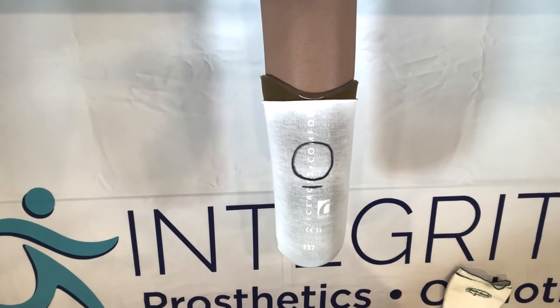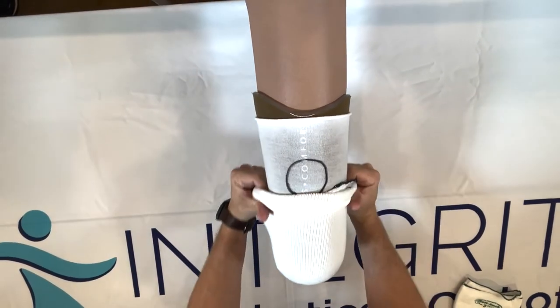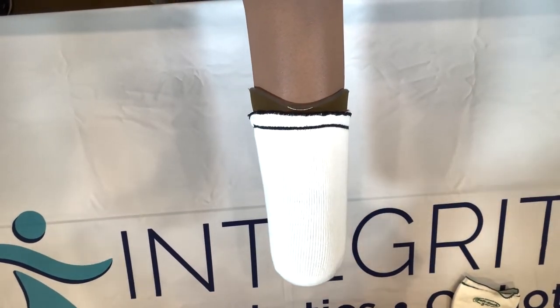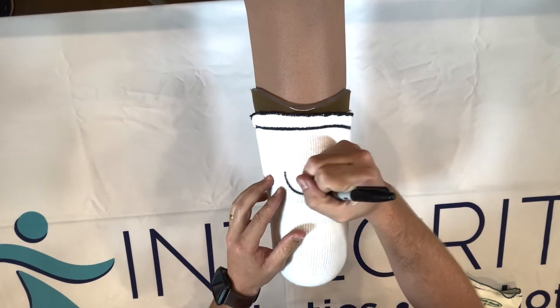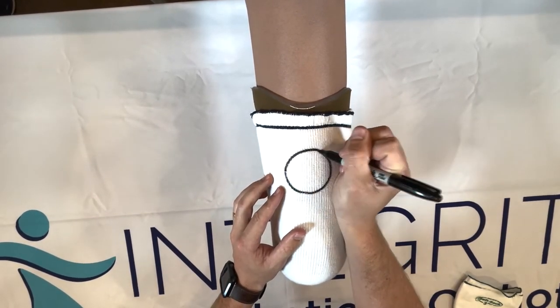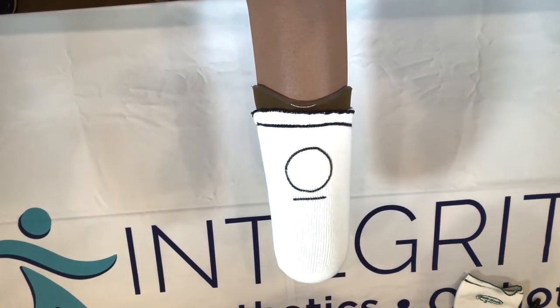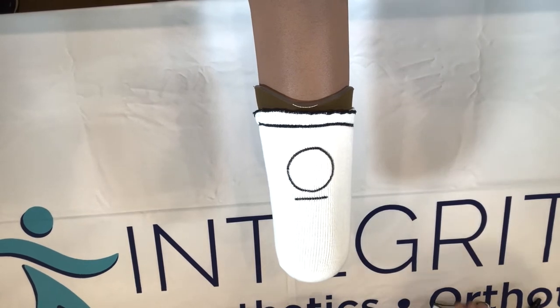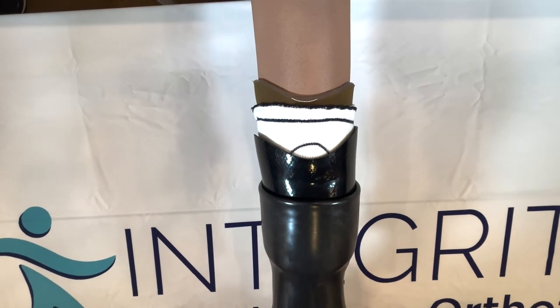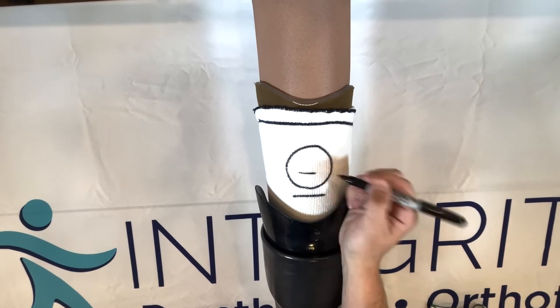First we're going to start by adding our five ply sock, and I'm going to draw through the sock so we can see where that kneecap is at. Our kneecap is still right there — that's right where that patella tendon bar should be at. We're going to try to push that prosthesis on, but it's still a little too low. We want the top of this socket to be right about there, and we can see we're still just a little loose.